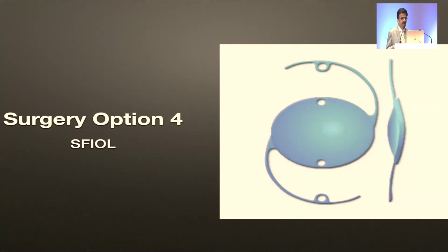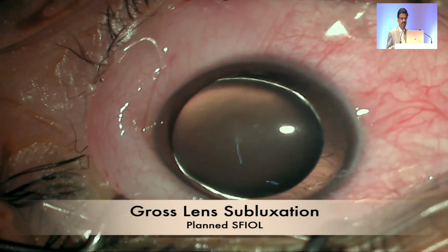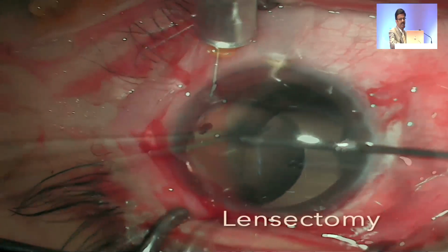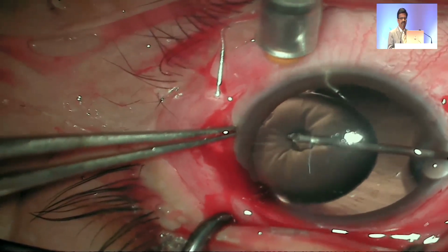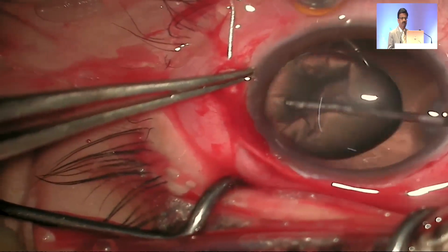And the final option we have is a scleral fixated lens. Again, preserve it for older children, maybe around 12 or 15 years. If you are operating, you can do a scleral fixated lens as a primary option, in which a lensectomy is done. As you can see, this is almost 270 degrees or more of subluxation.